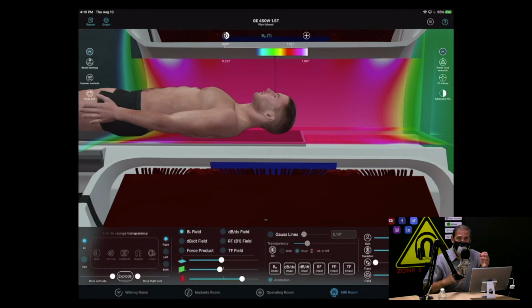So if I could, and do not do this at home, take a crowbar, a wrench made out of iron, into the center of an MR scanner and let go, it's just going to fall. It's so not intuitive, but in the center of that bore, there's no translation.